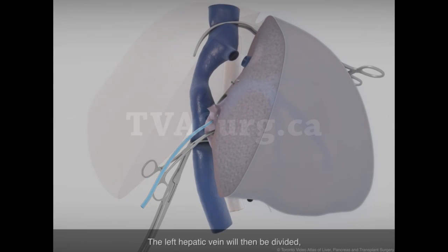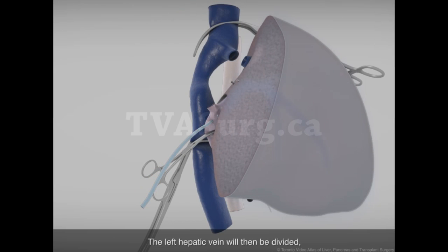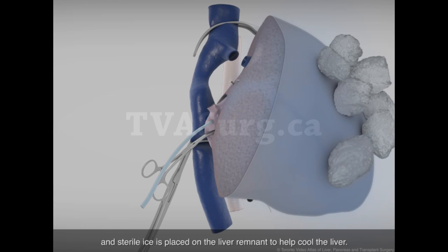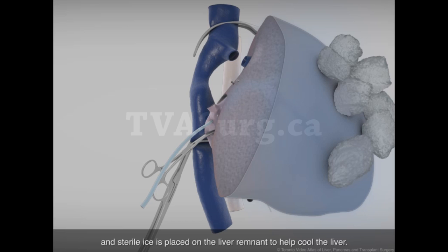The left hepatic vein will then be divided, and sterile ice is placed on the liver remnant to help cool the liver.